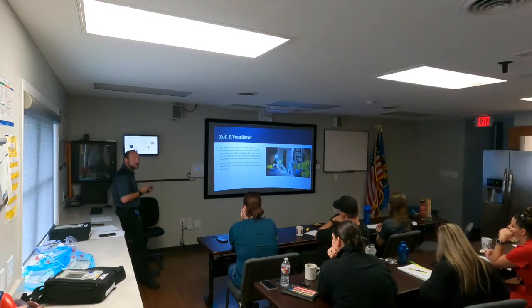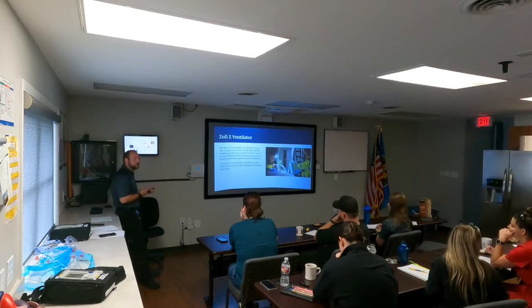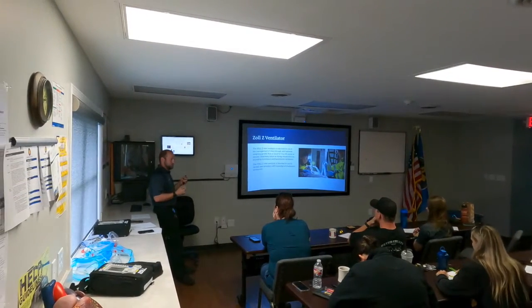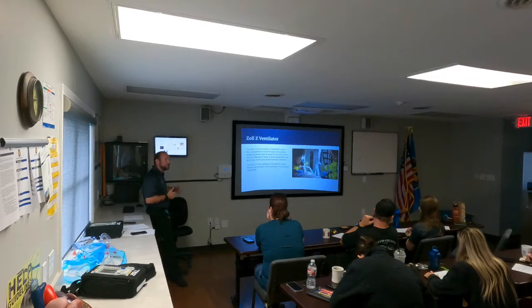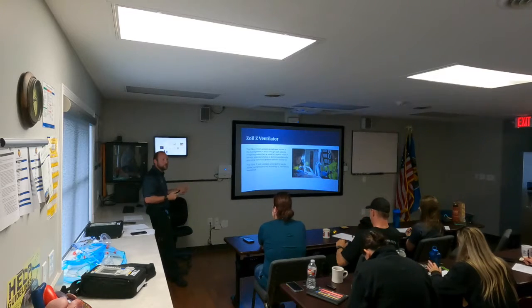You guys will be correlating this with Bothwell if you're taking any vent transfers, correcting the issues that they have, because they just love to throw it in the rescue mode, which is 500 of volume, a respiratory rate of 12, FiO2 of 100, and then just wing it from there. Hopefully someone figures it out, because they won't.